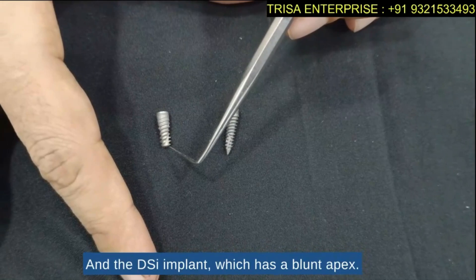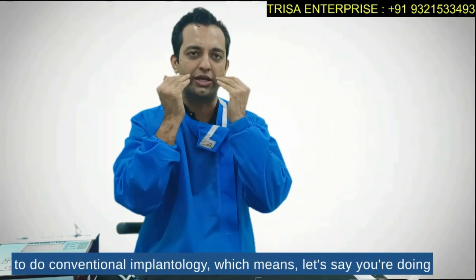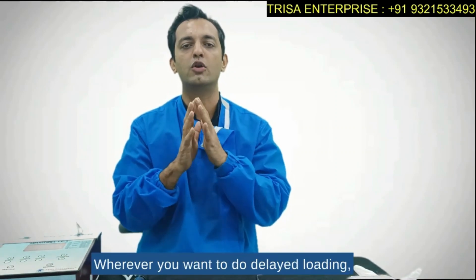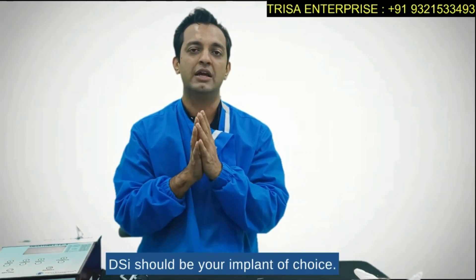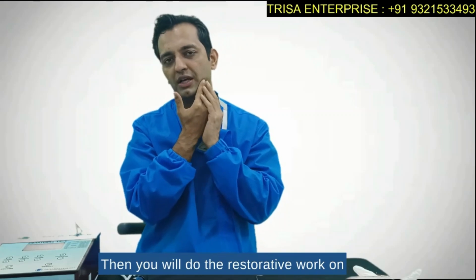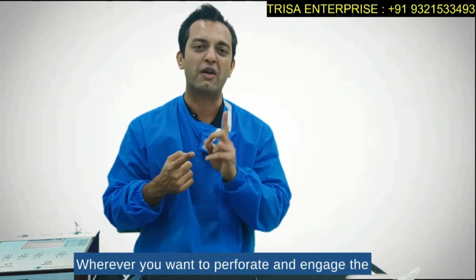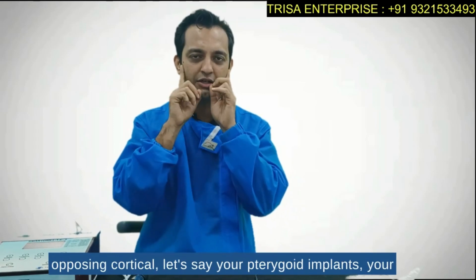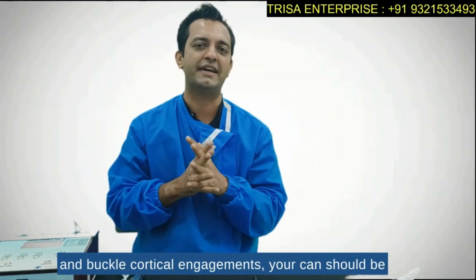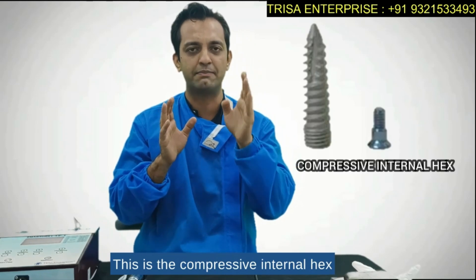Now, why are these two designs needed? Wherever you want to do conventional implantology — for example, an internal sinus lift — you should use a blunt end, which is the DSI implant. For delayed loading, DSI should be your implant of choice. Wherever you want to perforate and engage the opposing cortical — such as pterygoid implants, nasalis implants, trans-sinus implants, lingual and buccal cortical engagements — the CIH should be your implant of choice.